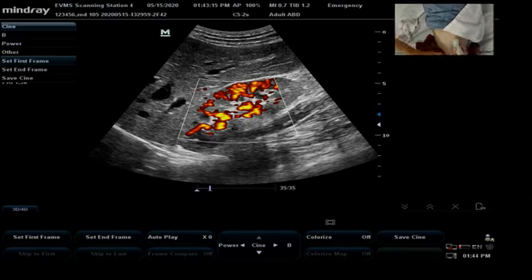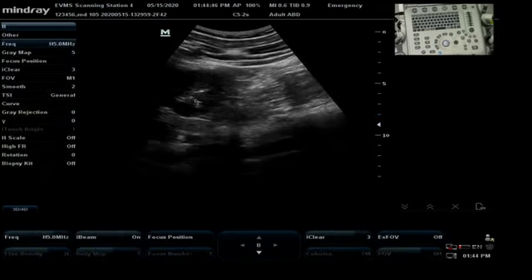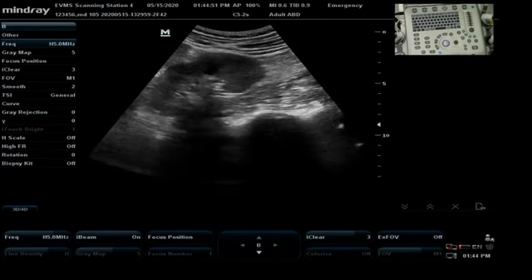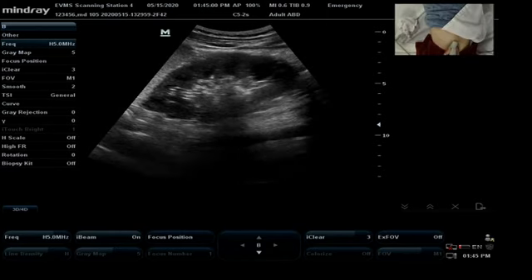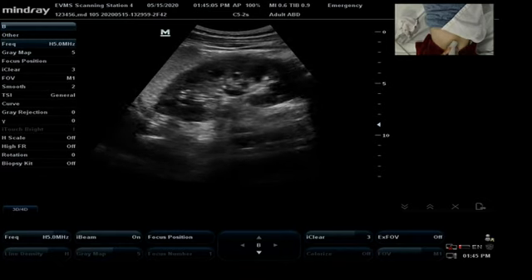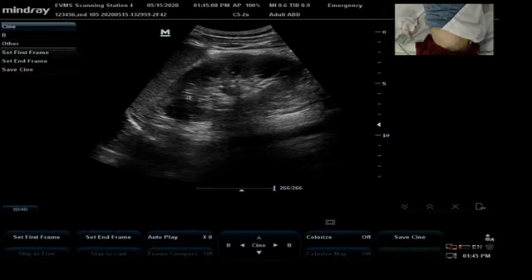So I'm gonna put my probe right on the waist at mid-coronal plane, and I'm gonna say, big breath in please. And I'm gonna rotate just a little bit clockwise and look at how much that kidney elongates. How do I know when a kidney is long? Well, if the poles are round, it's not long enough. And when you get the kidney nice and long, breathe, then you start to see that the poles get just a little bit pointy to them. And that can be a good tool to help you.